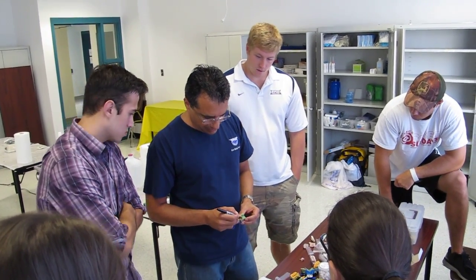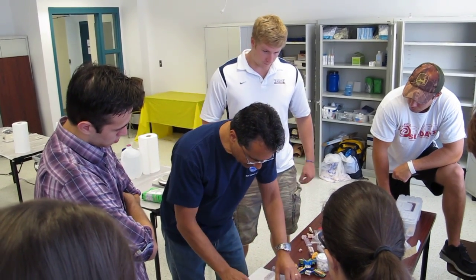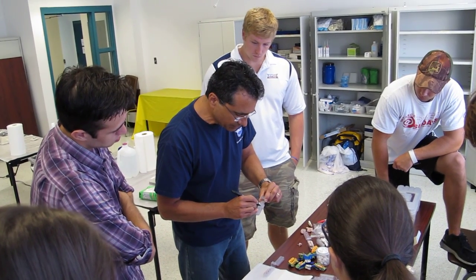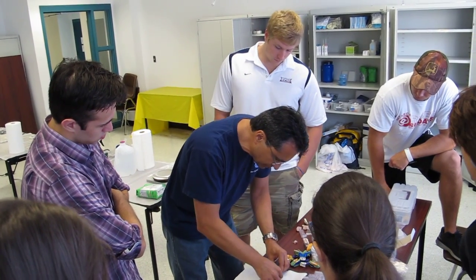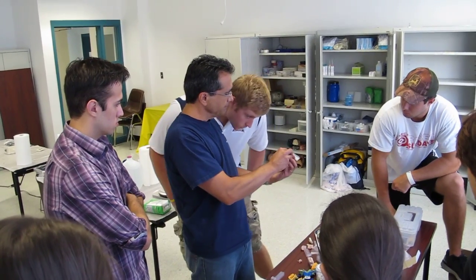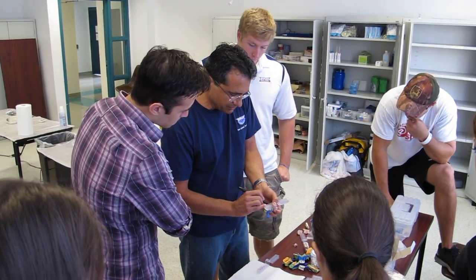Now we have the inlay tooth — again, mark the middle of that one. This particular impression doesn't have the inlay, but you'll estimate and mark it. Line up the articulator and mark with the pen. Look down — does that look right? Mark it, and now you know where that second pin goes.